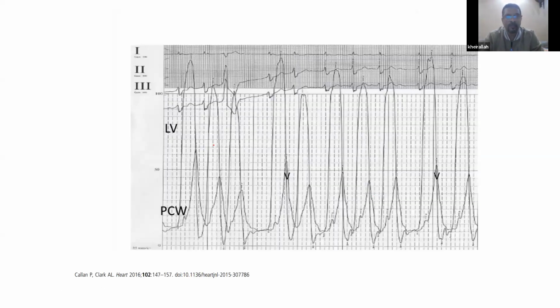Again, look here. This is less than ventricularization, but the V wave is still high. This is also severe MR. Okay, this is severe MR. So the marker of severe MR in hemodynamics is the V wave. Okay.